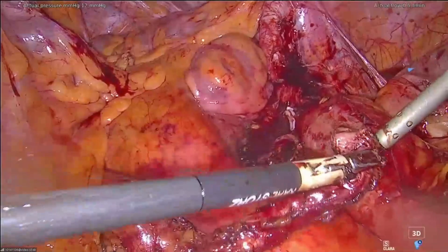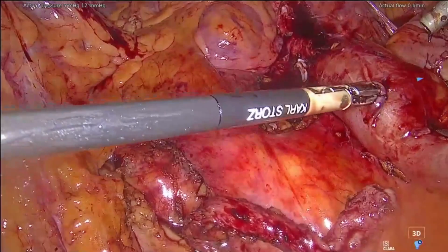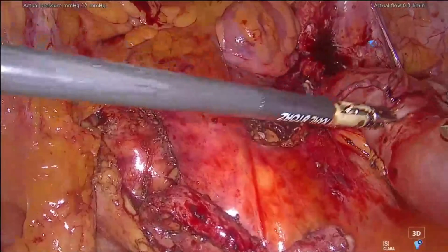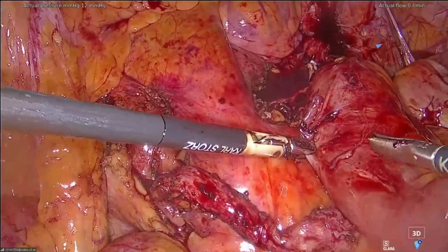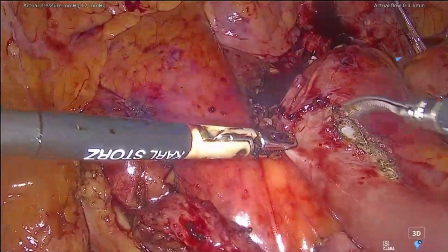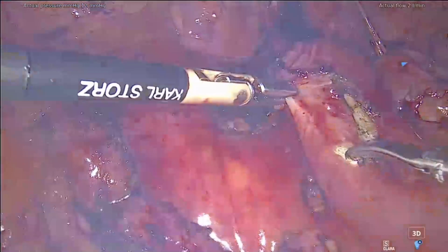And I just need to do a rectangle 2 centimeters wide, to be able to put this one at this level. And then I can do my anastomosis tension free there. And after, I have just to close the bladder. Okay. Can you push the suction here? Camera inside. Move your suction.